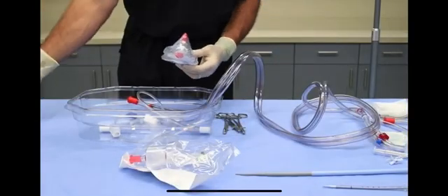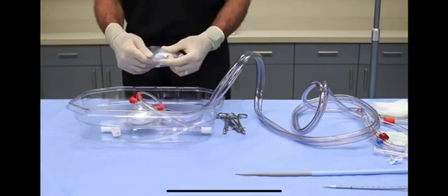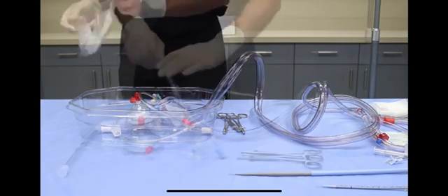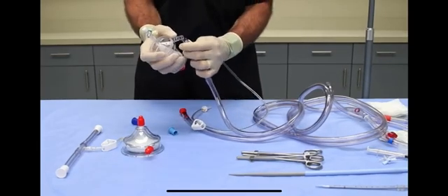Using sterile technique, open the packaging for both the pump head and the bubble trap. Also using sterile technique, place both in the sterile tray for circuit assembly. The perfusionist removes the blue vented cap from the circuit tubing and connects it to the inlet barb of the bubble trap.